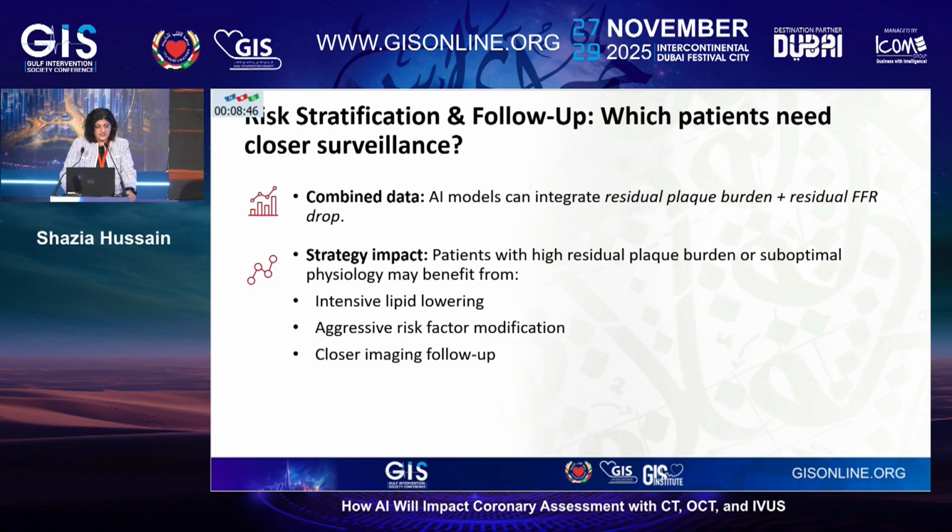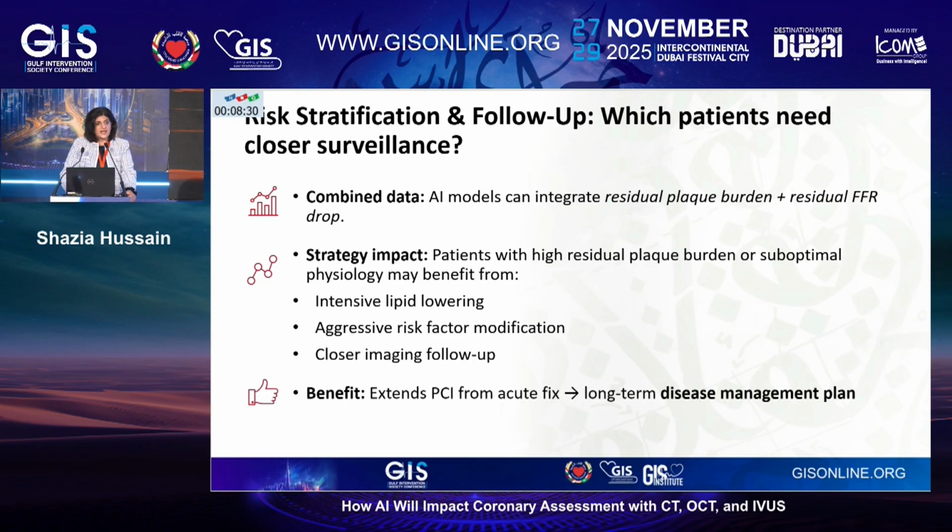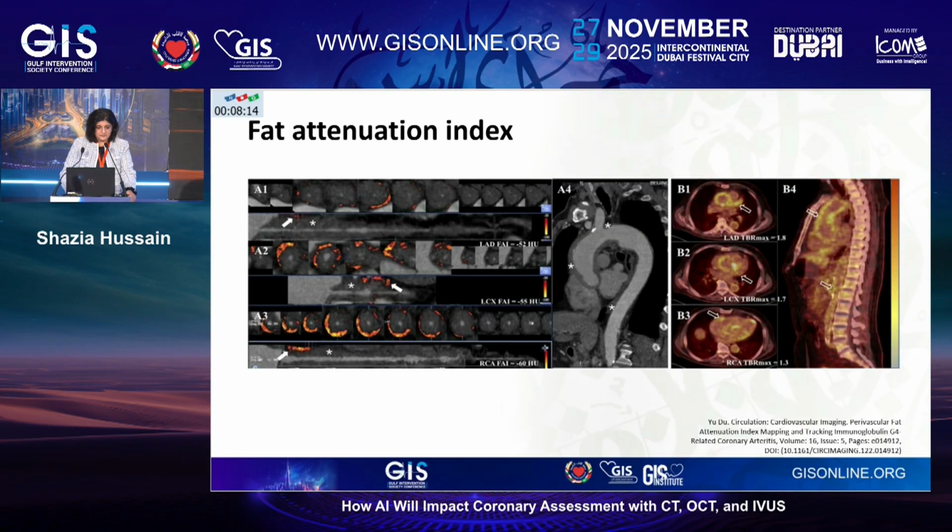And what it suggests is those patients who may still have a low FFR and a high plaque burden may benefit from intensive lipid lowering, risk factor modification, and maybe closer imaging follow-up. And this extends our management of coronary disease from PCI to long-term management. And I know we love the stenting procedure, but this is equally, if not more so, important for our patients.